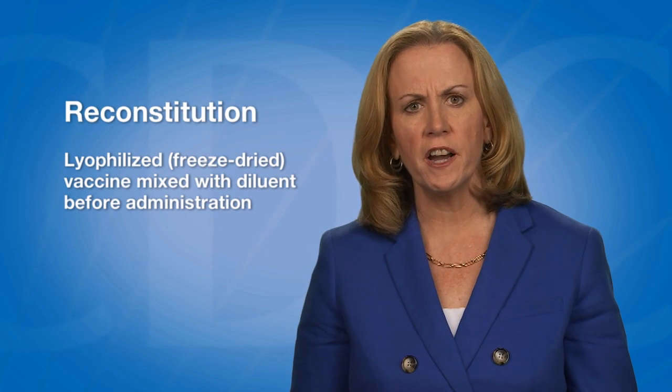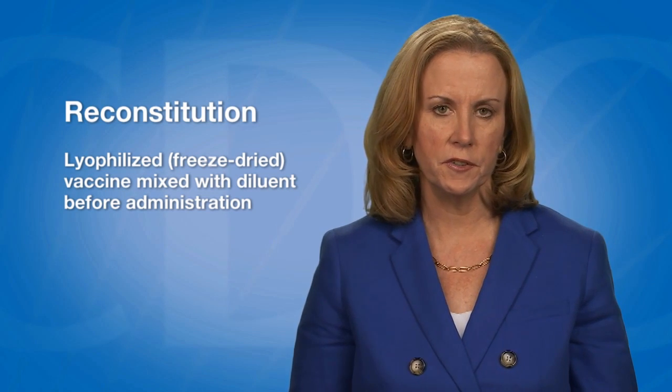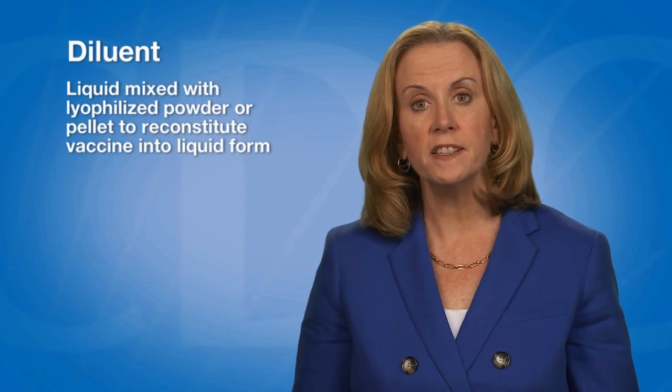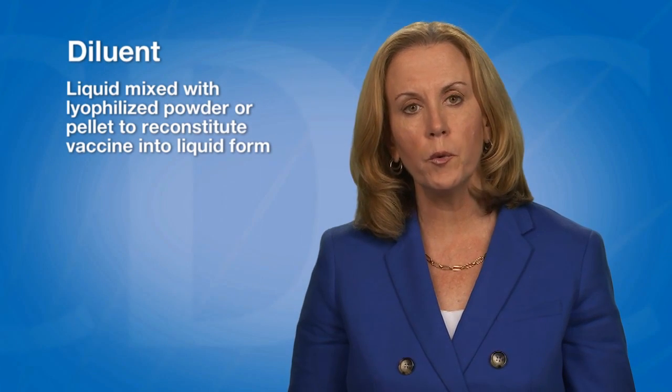In this video, I will describe how to reconstitute a lyophilized vaccine. Some vaccines come lyophilized or freeze-dried as a powder or pellet that must be mixed with a diluent before the vaccine can be administered. This process is called reconstitution. A diluent is liquid that is mixed with a lyophilized powder or pellet to reconstitute the vaccine into liquid form.